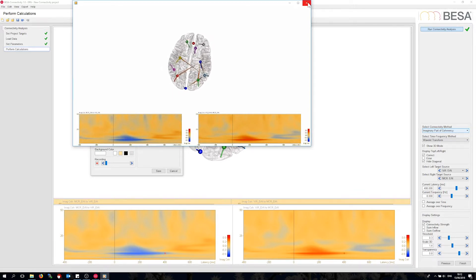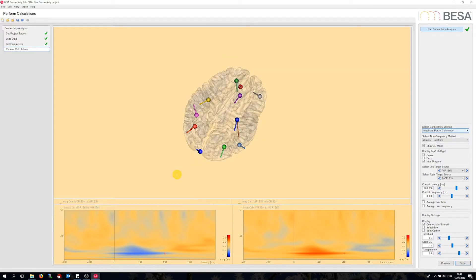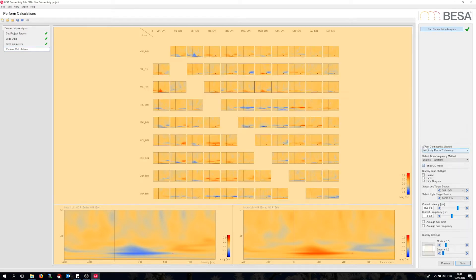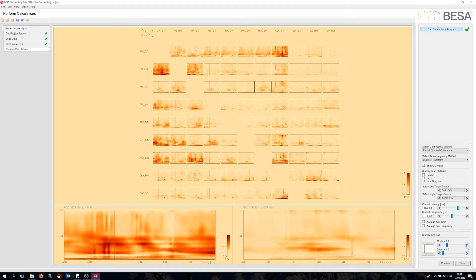Let me go back to the matrix plot now. I would like to compare the network with the one that I can find in partial directed coherence mode. This is a method that exploits the mathematical formalism of Granger causality. I first scale up to 2.0. If I look for clear peaks in the plot, I can see a connection again in the right hemispheric central-posterior part.